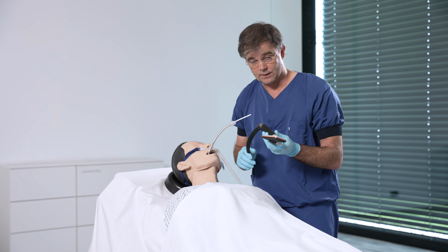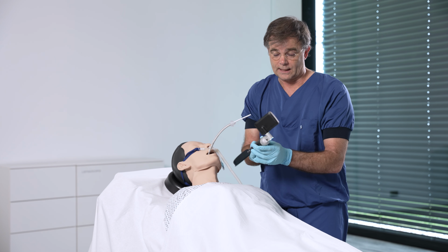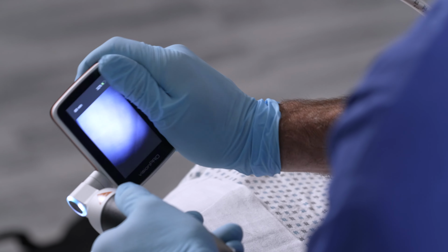So remember, hold the video laryngoscope like a Tomahawk and use a video laryngoscope with a big screen that can be turned in all directions.